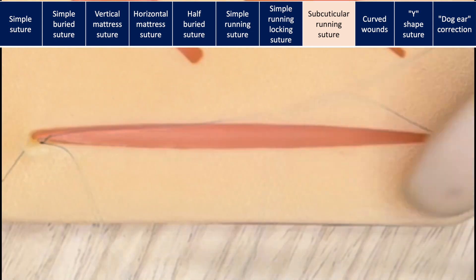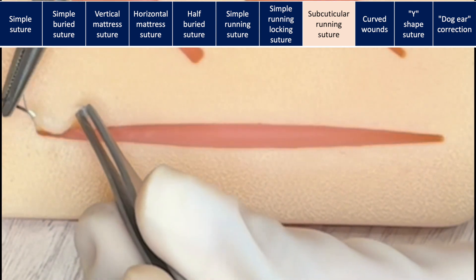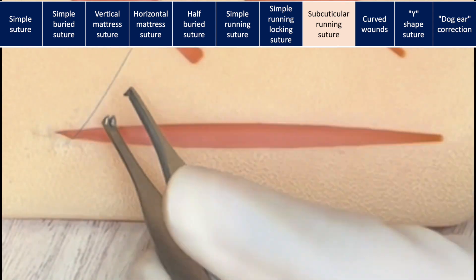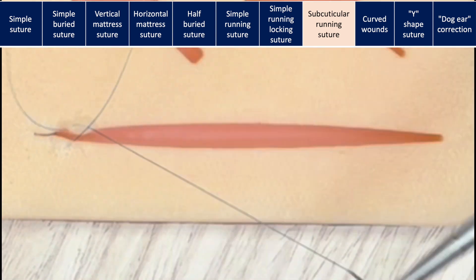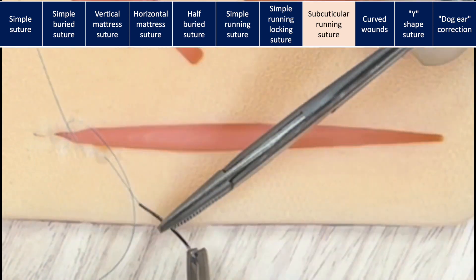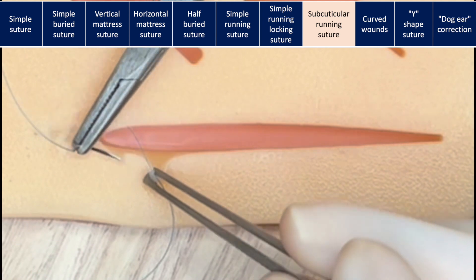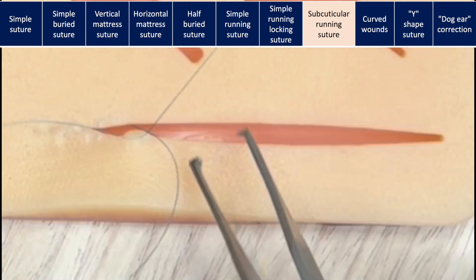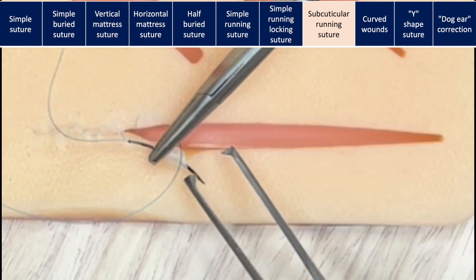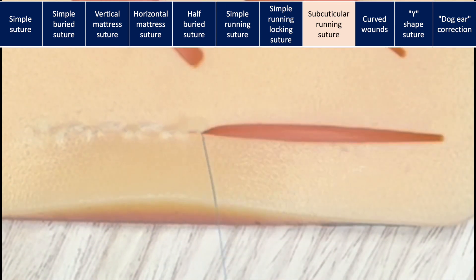Just at the epidermal-dermal junction, you should make horizontal bites to advance. The key here is to make consistent bites on each side, maintaining the same depth and the same amount of tissue each time. Your needle should enter right in front of where it exits, without going too far backward or forward, to prevent the wound from puckering or creating a dog ear deformity at the end of the suture.